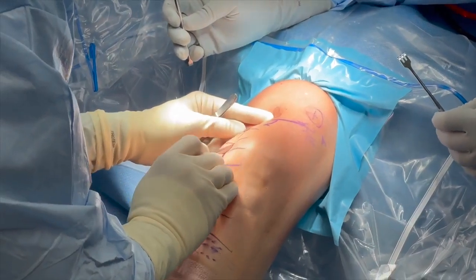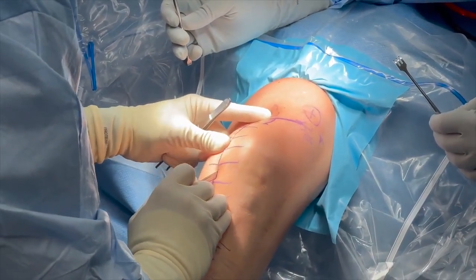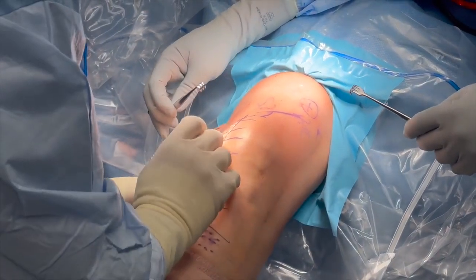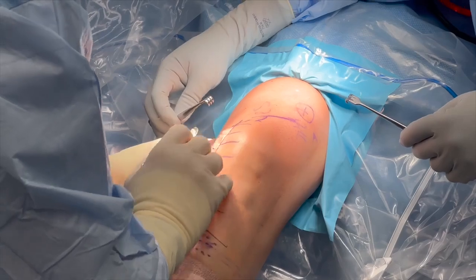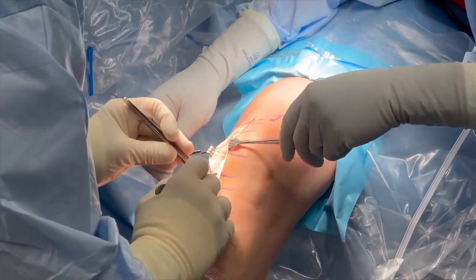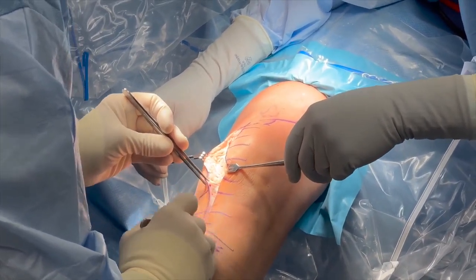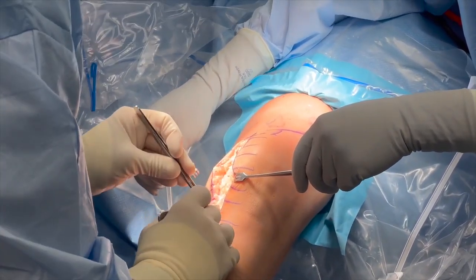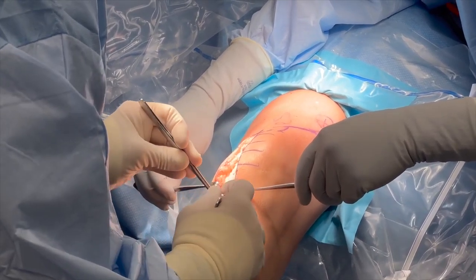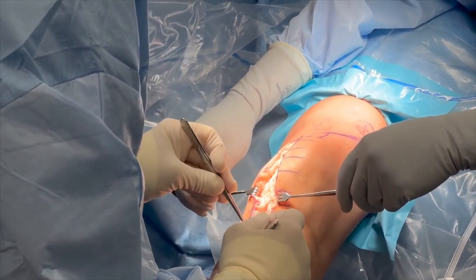An incision is made along the patient's prior incision from the distal aspect of the tibial tubercle to the proximal aspect of the patella. Dissection down to the heterotopic bone is carefully performed, and the dissection is continued posterior-medially to expose the posterior capsule for subsequent capsule release. This patient has significant scarring from her previous surgeries, which complicates the dissection.